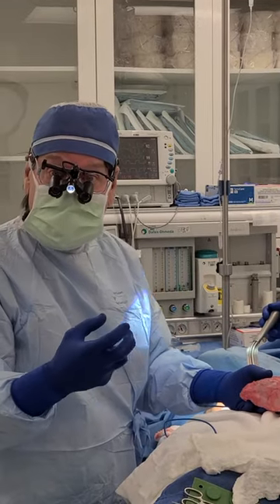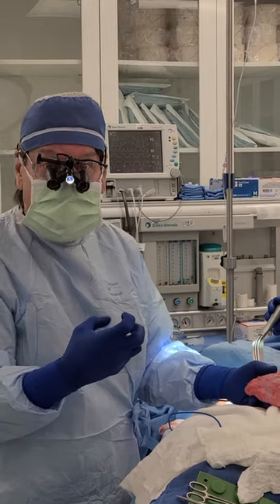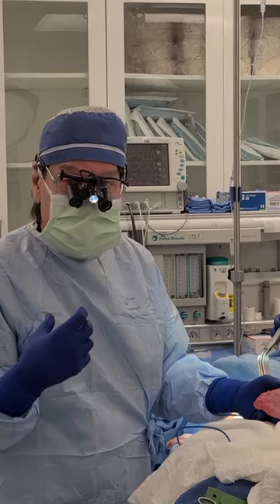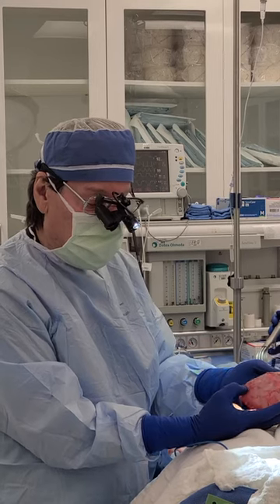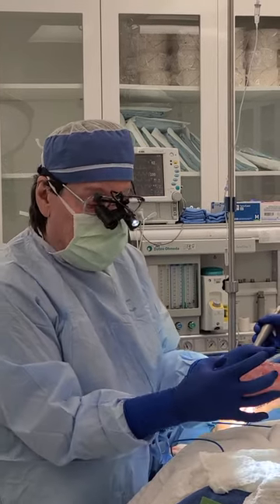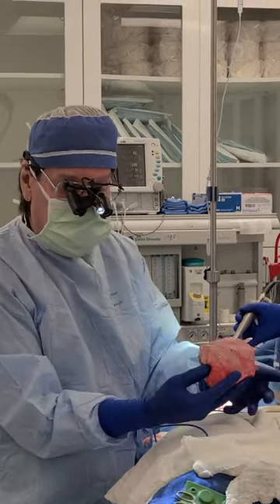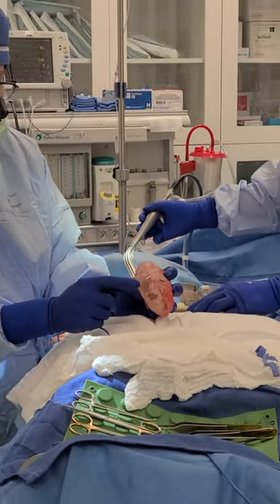Most of the things that we implant in people are made of titanium steel, and nothing in us is as strong as steel, so if a capsule contracts around a joint or a pacemaker, no one ever knows about it. Women want their breasts to be soft, so a breast implant is soft. When the capsule contracts around the implant, it deforms the implant, and you can see here the implant is folded in what's called a knuckle.